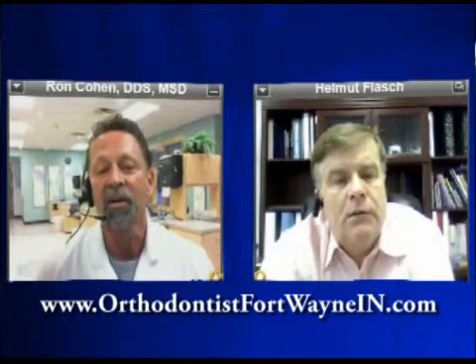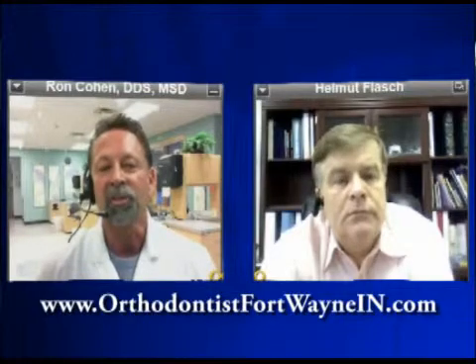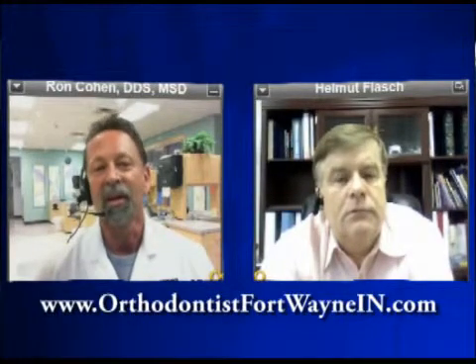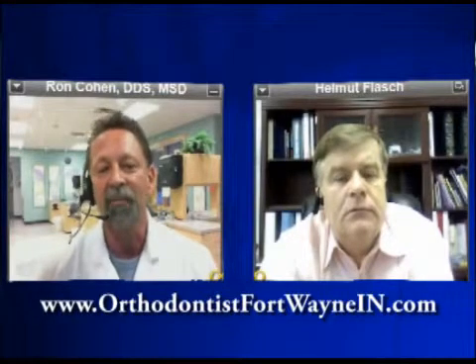On a couple of my adult patients, we found some carotid artery stenosis, things that they didn't even know about that could lead to stroke problems. In some of our younger patients, we found extra teeth that were in positions that, with the other X-rays we used to get, you couldn't see. There are a number of abscesses we saw on the sides of teeth that, with the type of X-rays we used to get, a 2-dimensional picture of everything squished together, you never really revealed the kind of things that we can see in just little slices that we can take now.